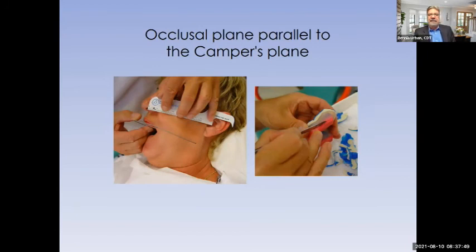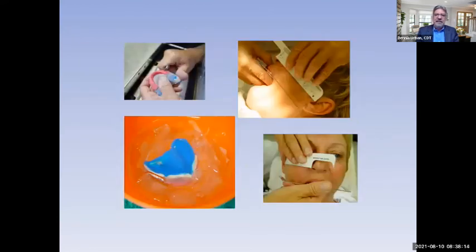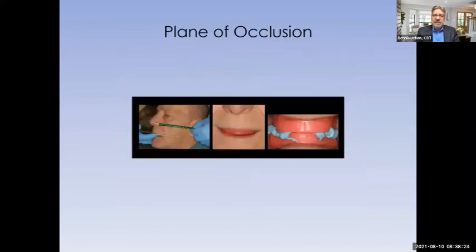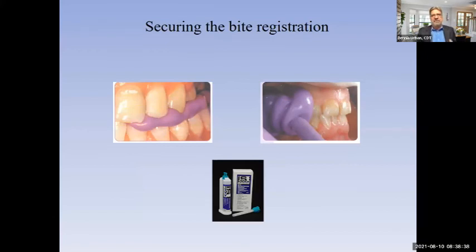The occlusal plane should be parallel to Camper's plane — from the tip of the nose to the middle of the ear. In this photo, the metal plate the doctor is using shows the occlusal plane sloping down. If left like that, we'd probably have a reverse smile situation. The doctor adjusted it by cutting away some wax, and now we have a nice, even occlusal plane — perfect guidelines for setting denture teeth correctly. Getting many bite registrations back at the laboratory with the posterior region too high — I can tell right away there's going to be a problem on the articulator.